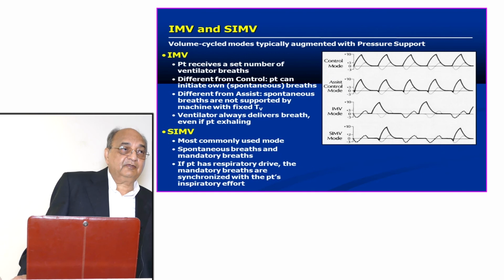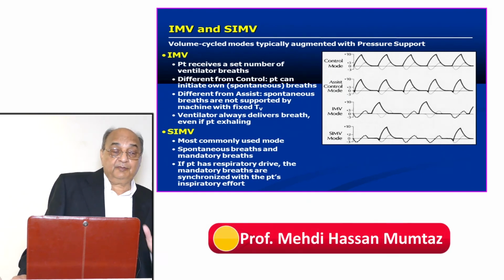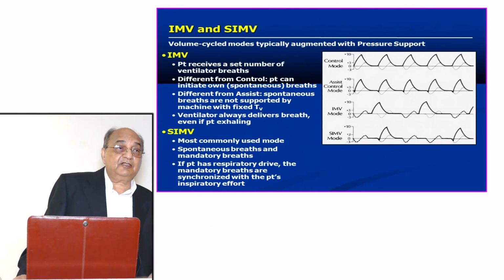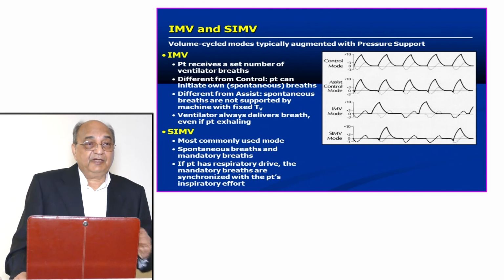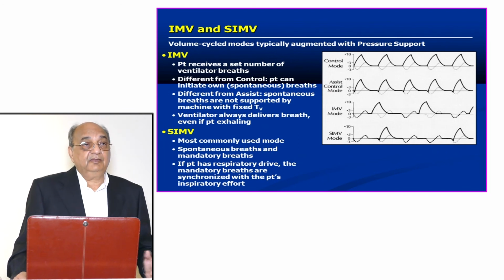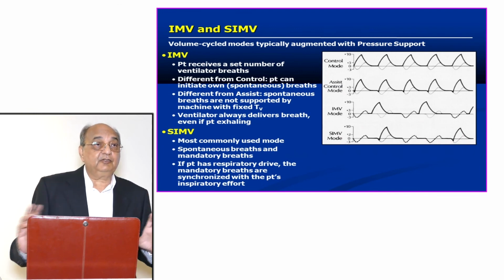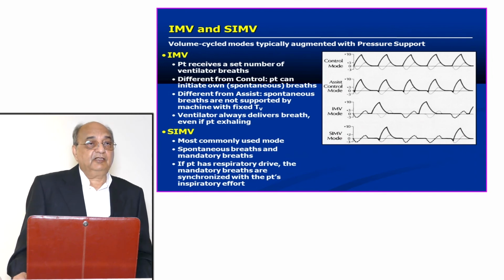Let him stop his breathing. Let her stop her breathing, and then the ventilator starts breathing again. So that is synchronization between them, right? So this is a better mode, and you put it on as soon as you put on a ventilator and you think the lungs are recovering. Now it doesn't need to be completely apneic. Let him breathe. Then you put on this mode, and gradually the patient takes over.